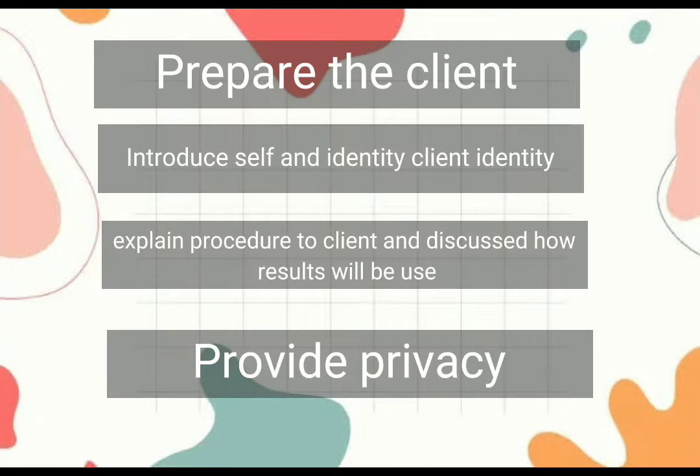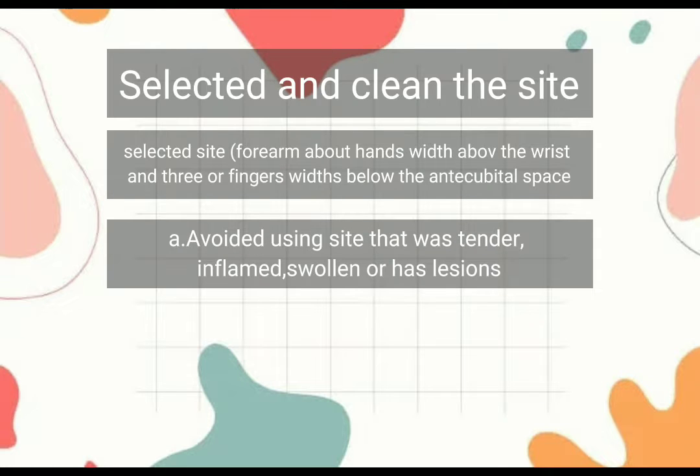Prepare the client. Introduce self and verify the client's identity. Explain the procedure to the client and discuss how the result will be used. Provide privacy. Select and clean the site. Select the site, avoiding a site that is tender, inflamed, swollen, or has a lesion.